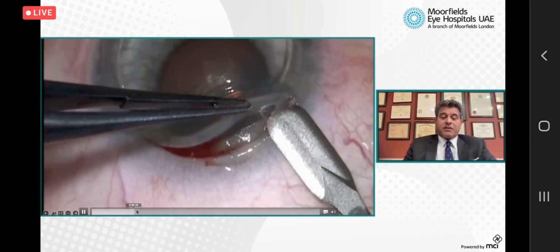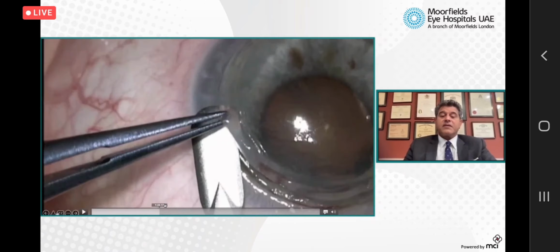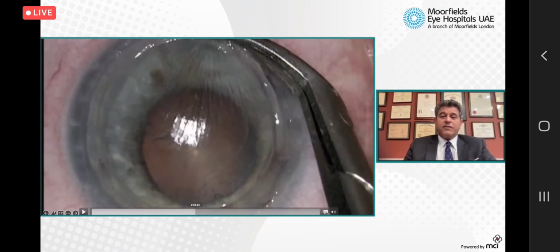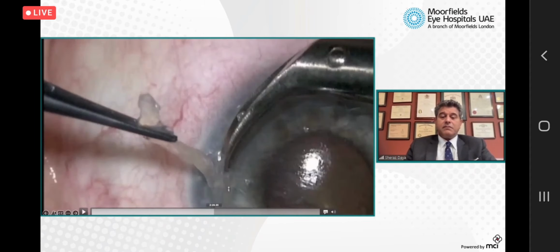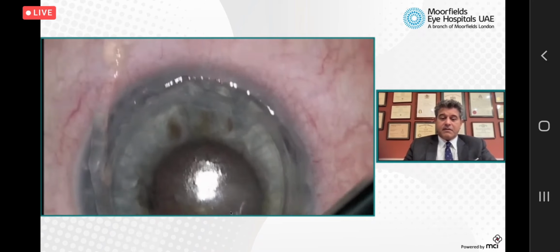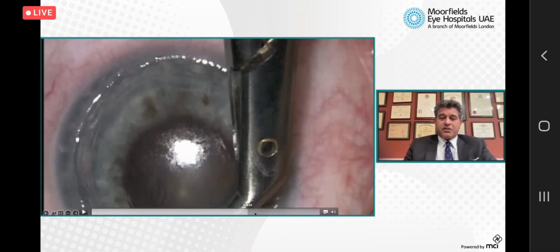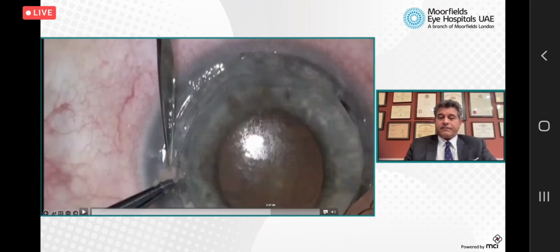And without boring you too much, I'm going to move on a little bit. And we see we go all the way around 360 degrees. And once that's accomplished, then we remove the wedge of tissue that's abnormal using scissors, curved corneal scissors, and cutting fairly vertically. And that's kind of hidden there in the video. And once that's been accomplished, we then go ahead and we suture that cornea to itself.